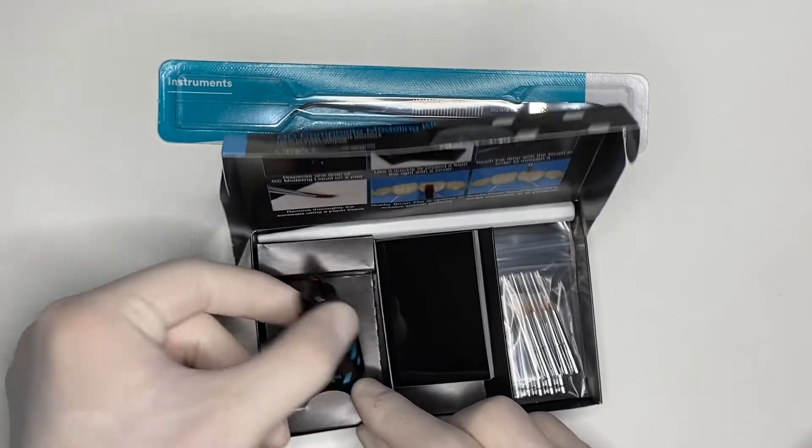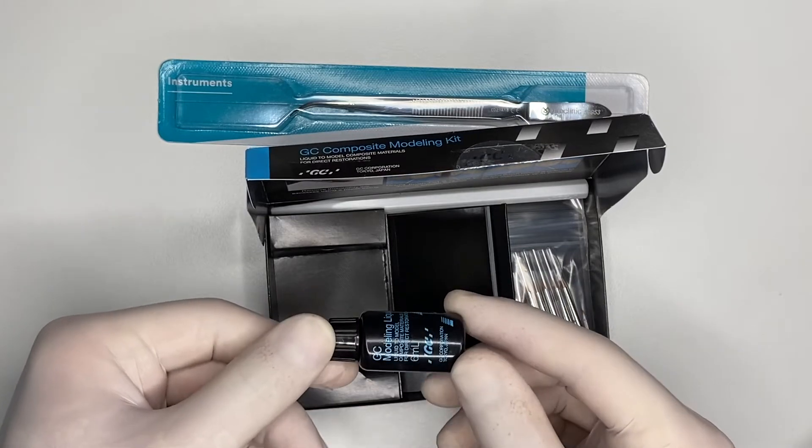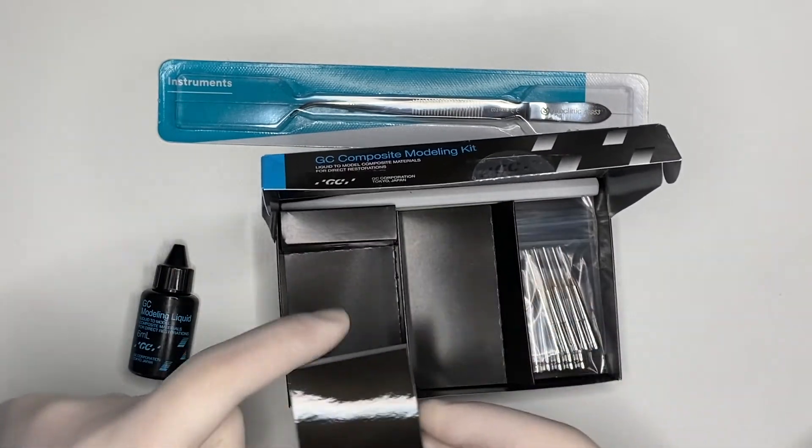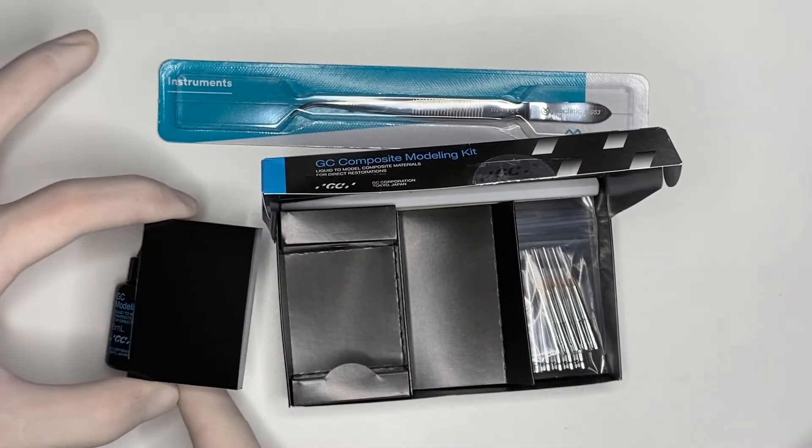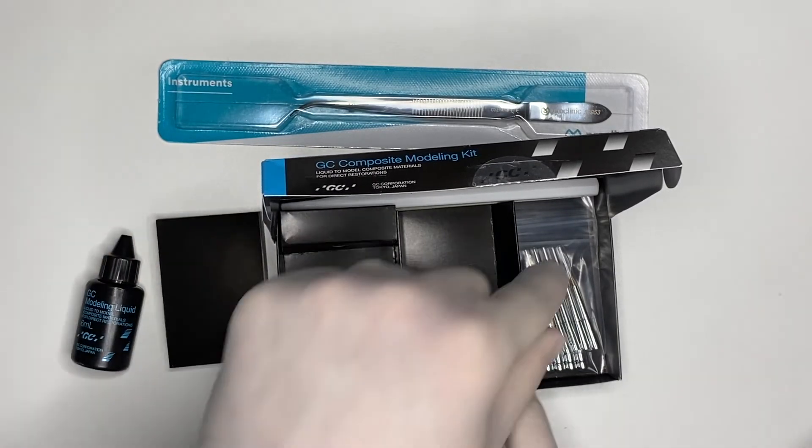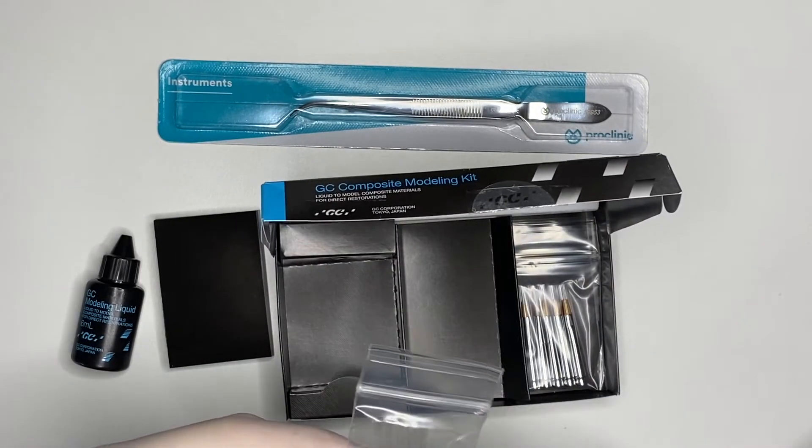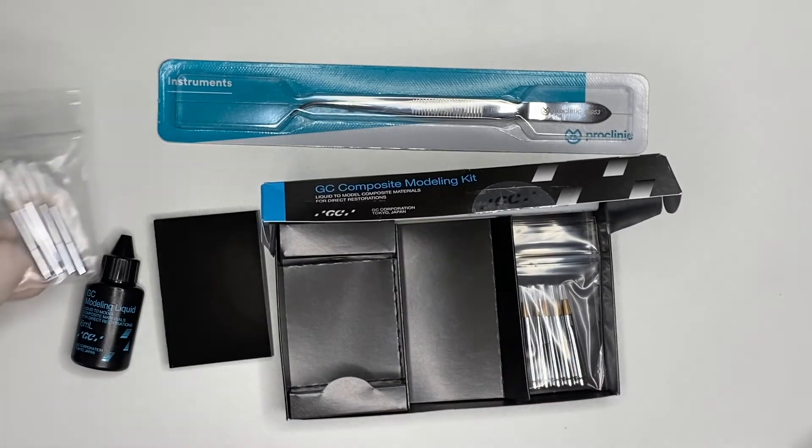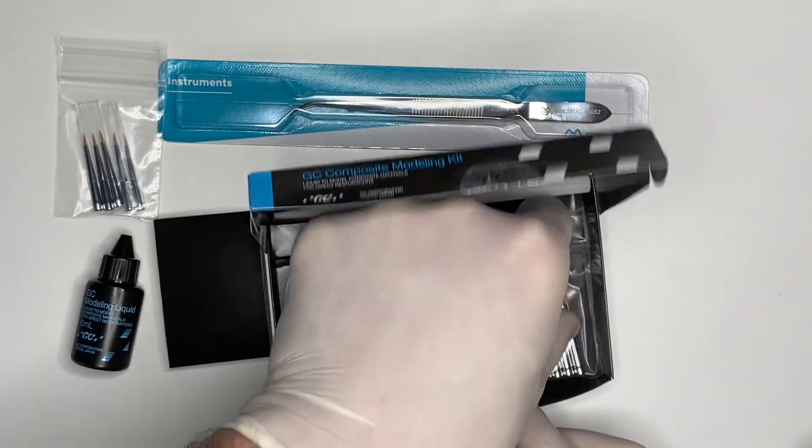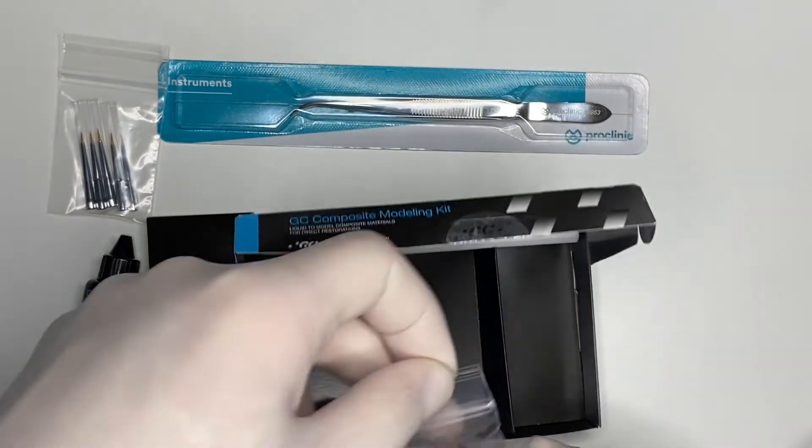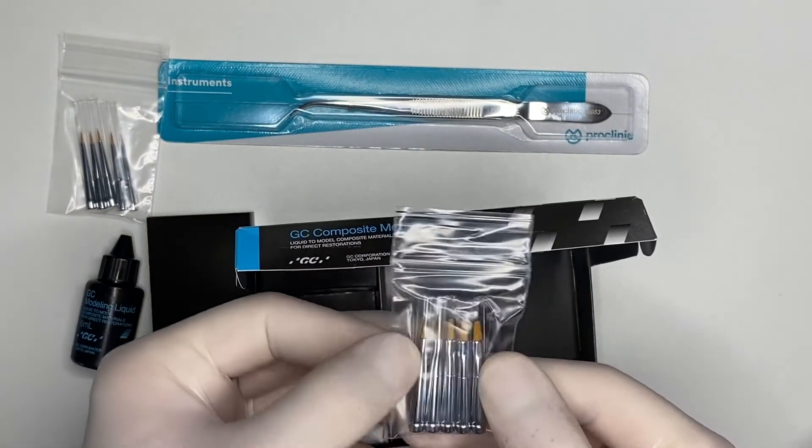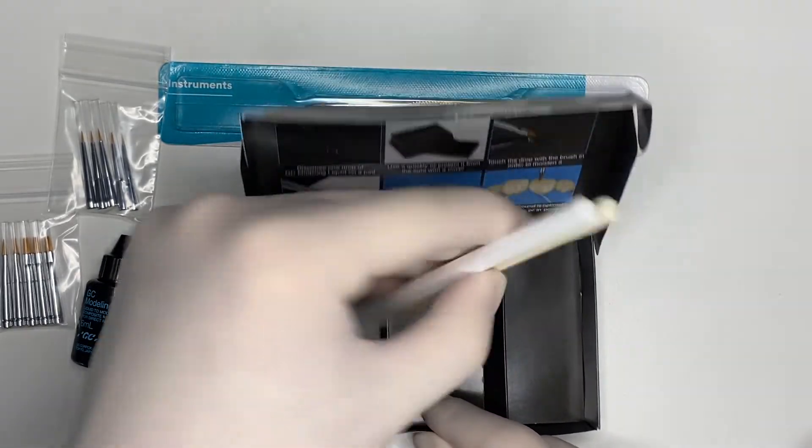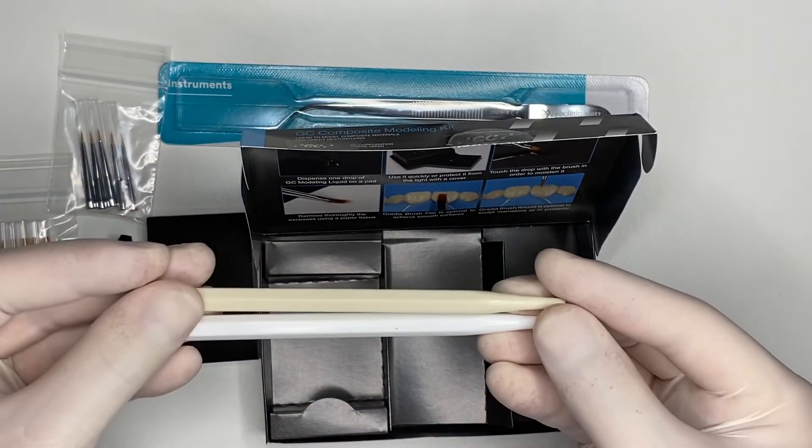First, the modeling liquid itself, a copious amount of pads, five round head brushes, and also five white brushes.